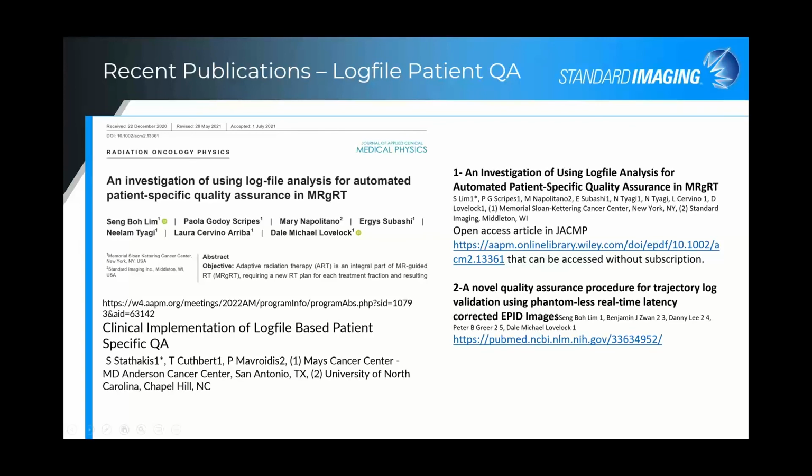This particular study compared 54 VMAT patient plans, a Delta 4 was used for measurements, and this clinic is using the research treatment planning system, which was new for LinacView, so we had to go in and make a few adjustments for them and help them out with a few things. And so far, in general, the LinacView log files were able to predict that a VMAT beam would pass the patient-specific QA criteria when measured with the Delta 4 Phantom at a rate of 85%. And they have more comparisons in progress as well.